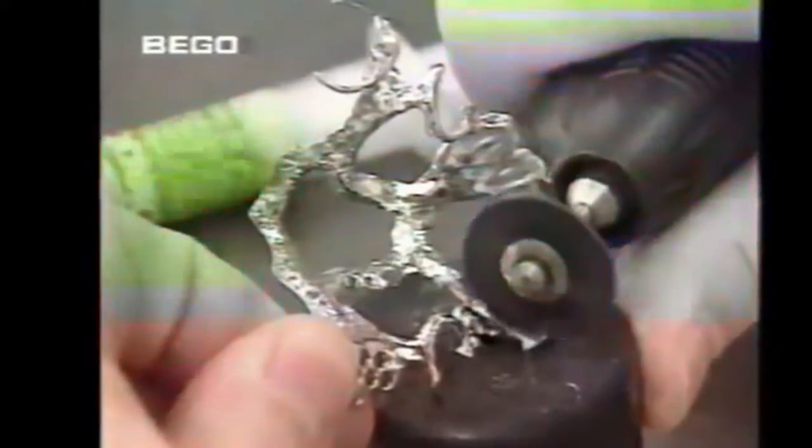The handpiece brush can be used with cobalt chrome and diamond polishing paste, as shown here, to improve polishing of metal masticatory surfaces or backings. Finally, the frame is high polished with soft linen.